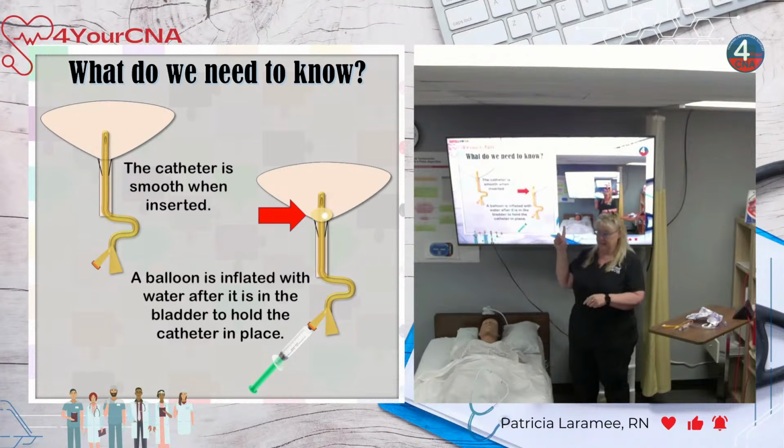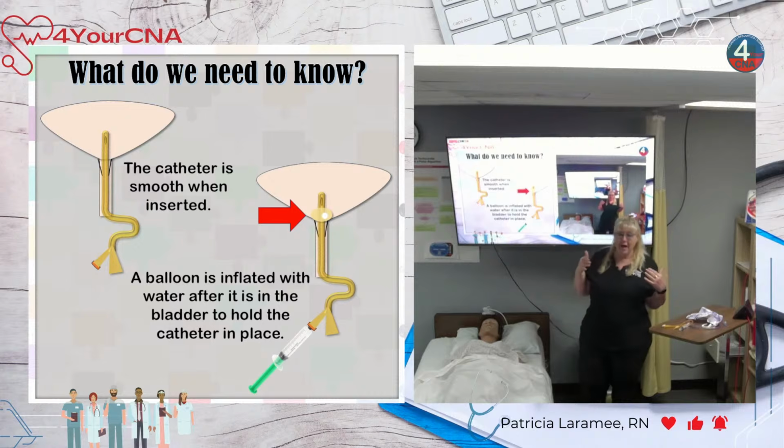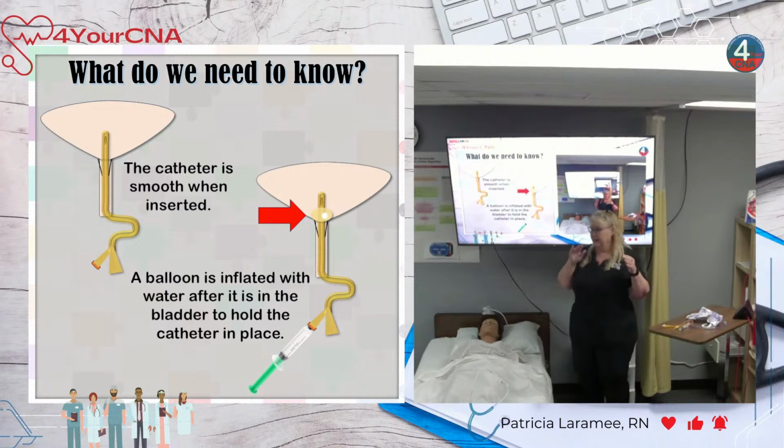Good? Make sense? Now, some people will have a different kind of a reaction with catheters, and it all has to do with this hitting the top of the bladder again. Instead of a Charlie horse, this time with these people, way more common, they feel like they have to pee. So they have a catheter in, they'll call, they'll go, I feel like I got to pee. And CNAs will go something like, well, just go. It's just going, they're opening that valve, which is being held open by the tube. So you're telling them to do something that's statistically impossible. They can't open a valve that's already open.